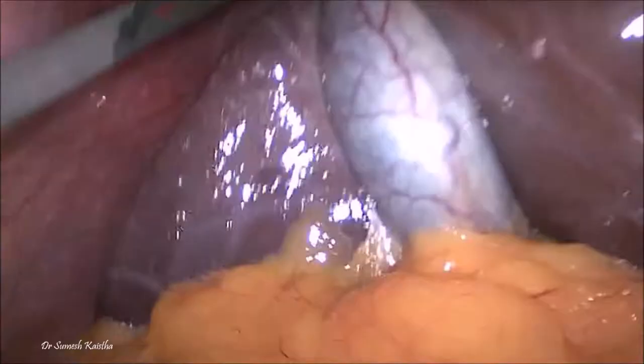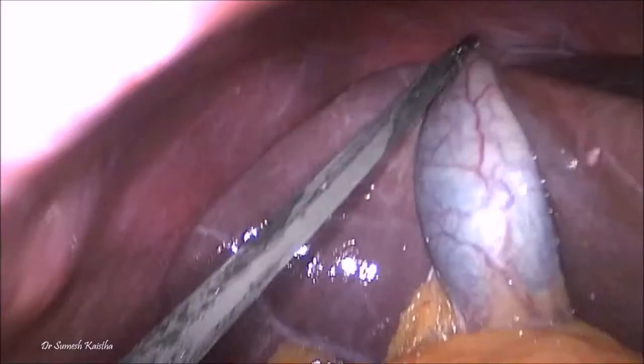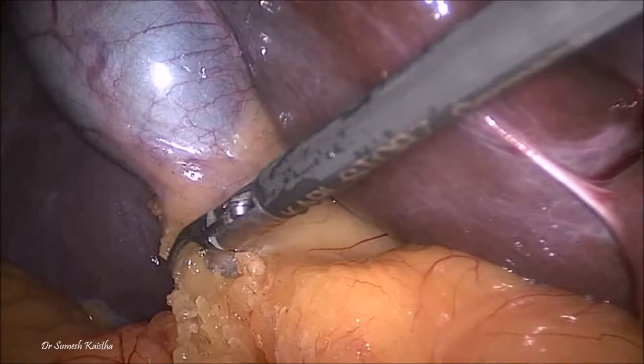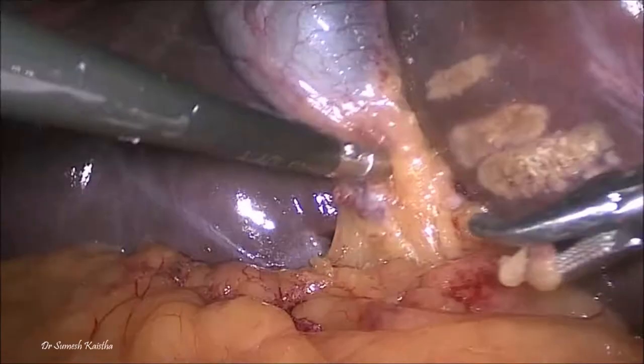Exposure of the porta hepatis is obtained by elevating the gallbladder and the liver and pushing it towards the right upper shoulder using a ratcheted grasper, which is then handed over to the side. The patient is then placed in the reverse Trendelenburg position with 30 degree right side up.